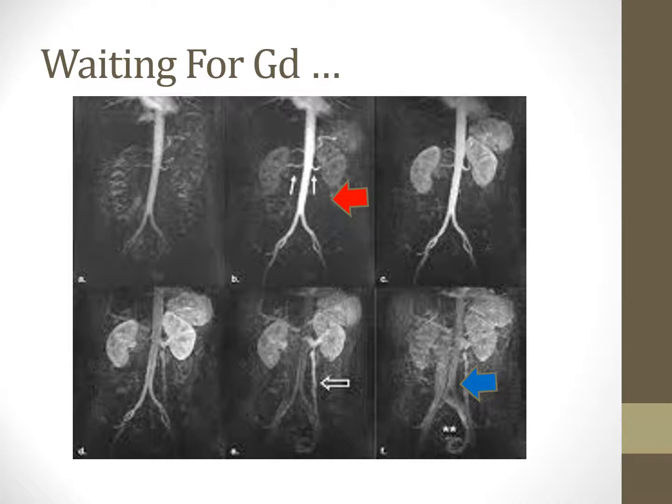Now, the reason image B is so good to note is that here is where we would want to demonstrate our renal vessels. We can also see our gastric and our splenic vessels in this particular timing for this exam. By the time we get all the enhancement of the kidneys in image C, we really have obscured the splenic artery totally. And so there's not as much diagnostic information there. So image B would make a great first pass arterial phase.